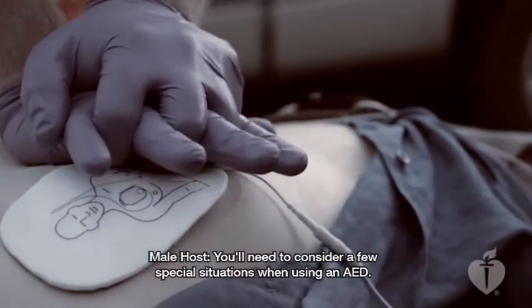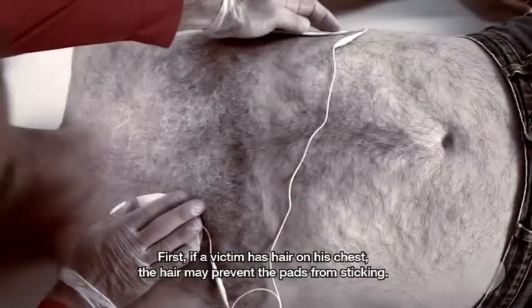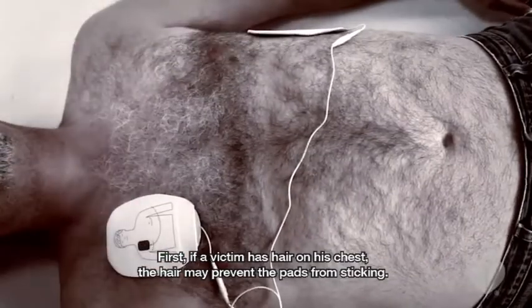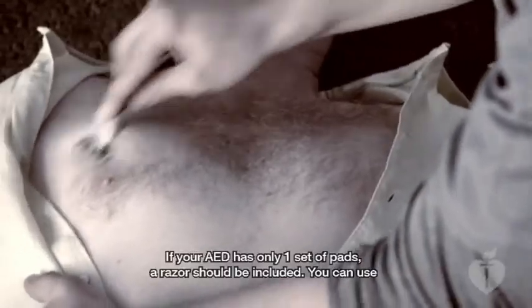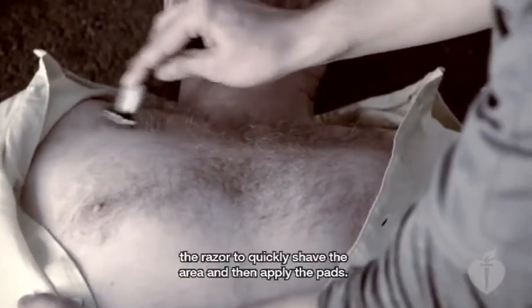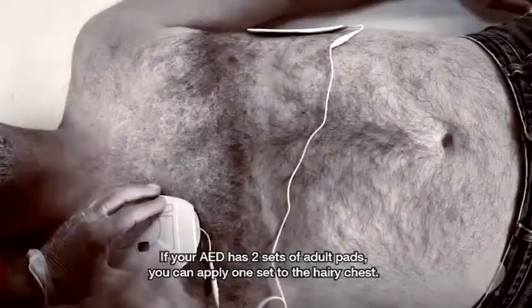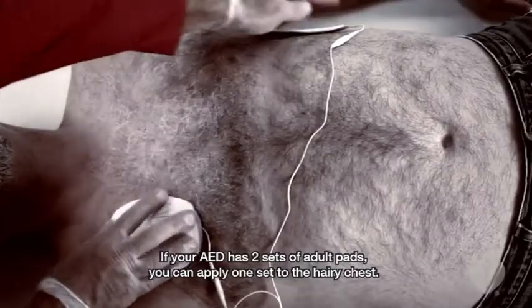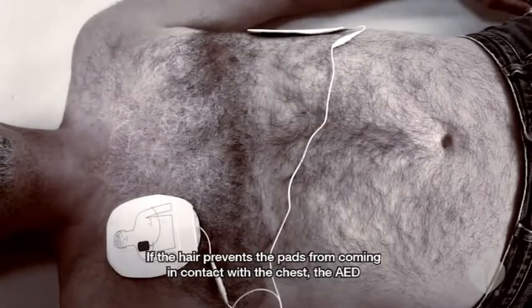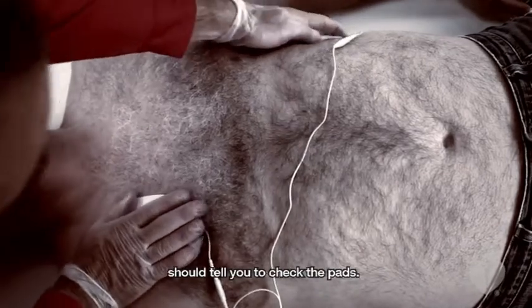You'll need to consider a few special situations when using an AED. First, if a victim has hair on his chest, the hair may prevent the pads from sticking. If your AED has only one set of pads, a razor should be included. You can use the razor to quickly shave the area and then apply the pads. If your AED has two sets of adult pads, you can apply one set to the hairy chest. If the hair prevents the pads from coming in contact with the chest, the AED should tell you to check the pads.